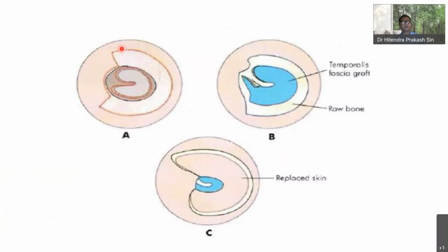This whole tympanomeatal flap has been lifted up and it is attached to the malleus handle only and placed superiorly. This tympanosquamous suture line and tympanomastoid suture line are the two suture lines from where the vessels enter into the tympanomeatal flap. We try to preserve these. This is known as the vascular strip incision.